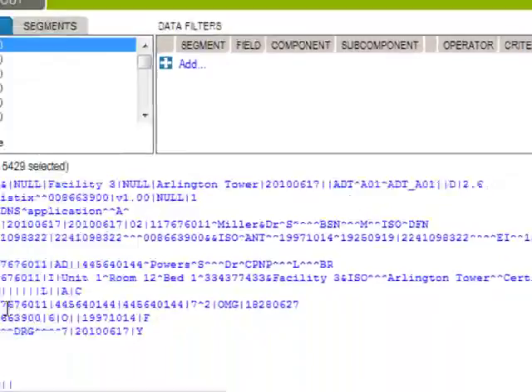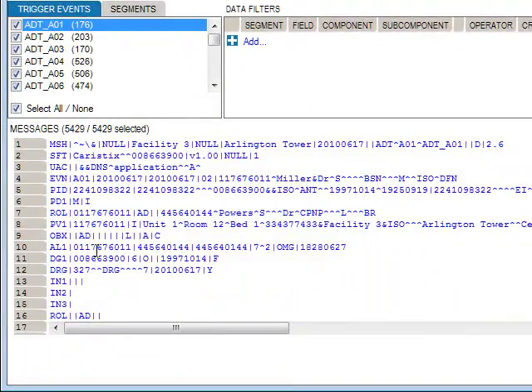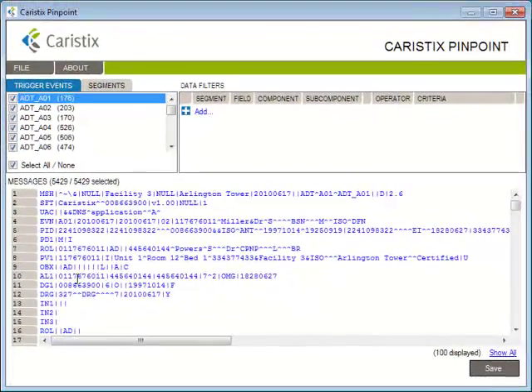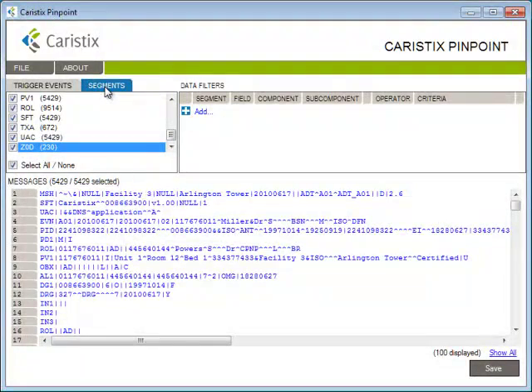Let's start with trigger events and segments. If you're looking for a segment, just click on the segments tab up here, and you'll see a list of the segments in this message log.